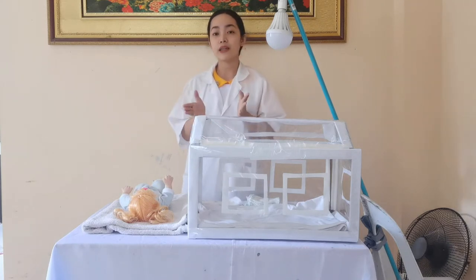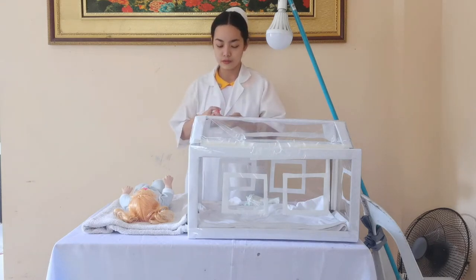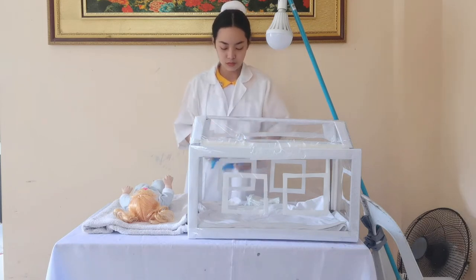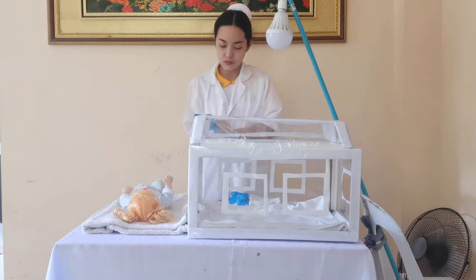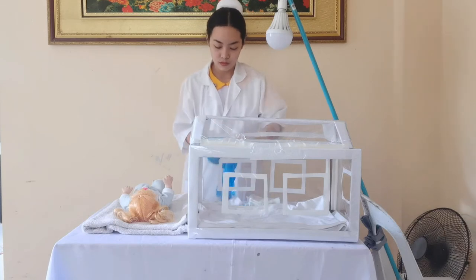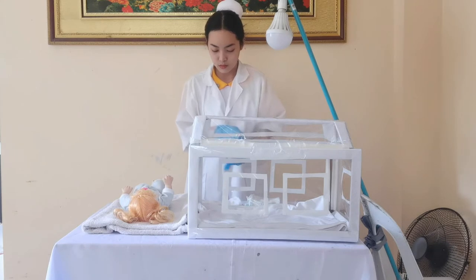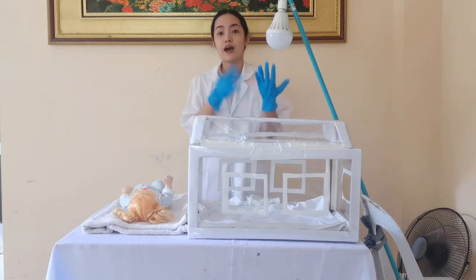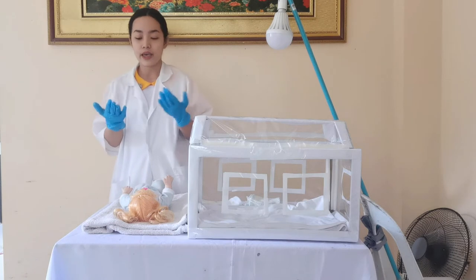Moving on to the procedure or implementation. First, we will perform hand hygiene, wear gloves, and other infection control measures. After that, we will now undress the infant and put on the diaper.